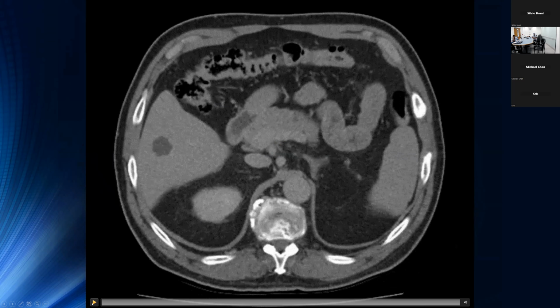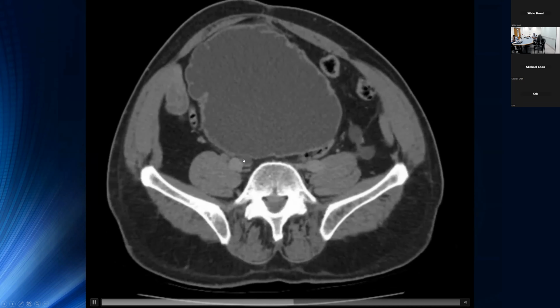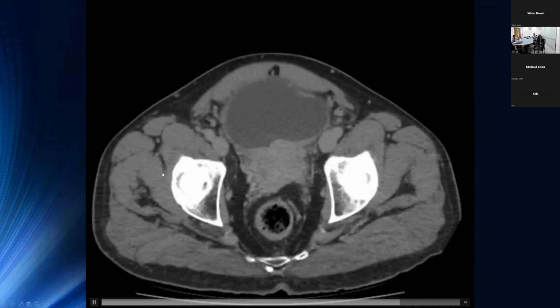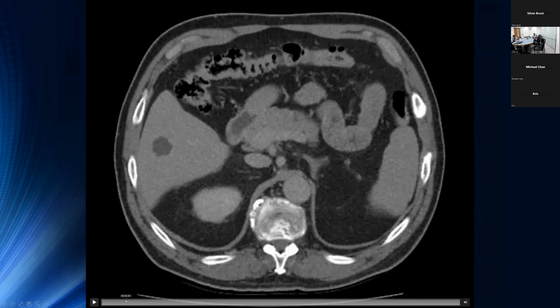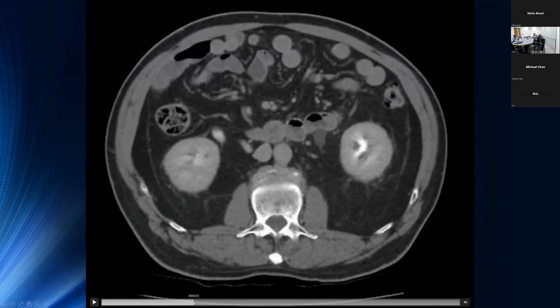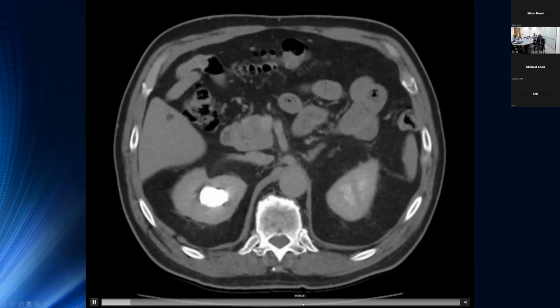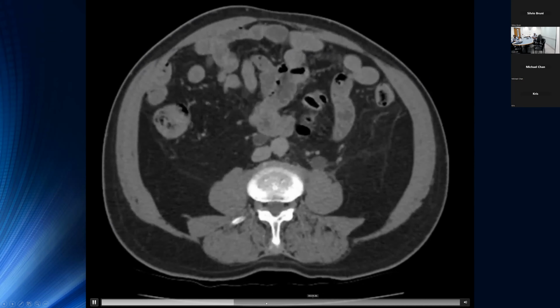Here, another case of, in this case, bilateral hydronephrosis and hydroureter, where the contrast appears to mostly layer dependently within these dilated renal calyces and pelvis, and really not much contrast getting into the ureters, a little bit on the right into the proximal ureter, but really beyond the proximal ureter, there's nothing in this dilated ureter here on the right and then here on the left, and all the way down, really nothing going all the way down.